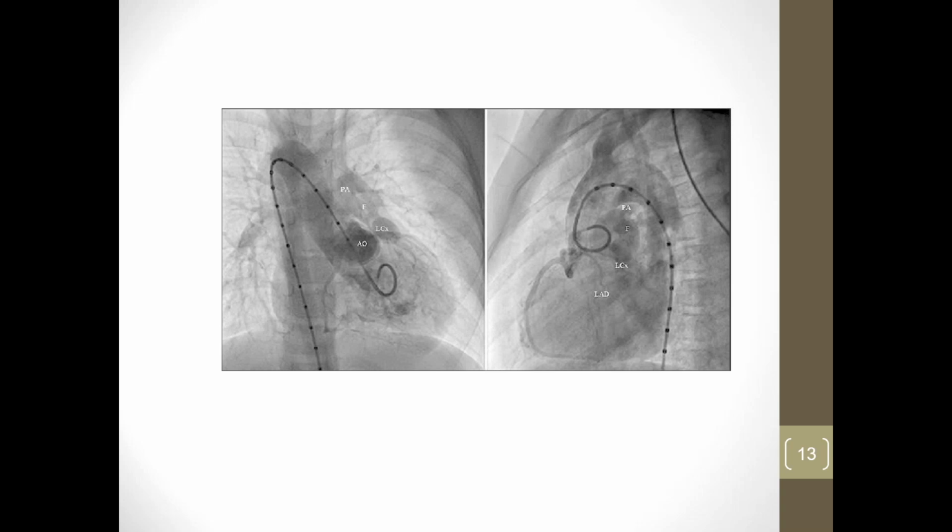So this is actual catheters inside the heart. It's probably hard to see from where everyone's sitting, but there are little dots along the catheter up along the whole distance of it. And those little dots are markers that allow the cardiologists to measure where they're at, because they have to come back with other catheters.